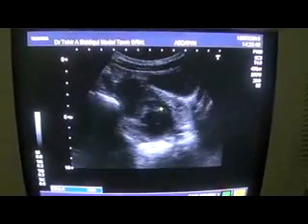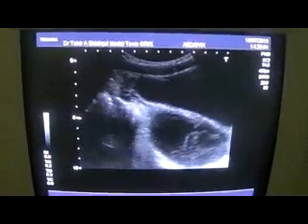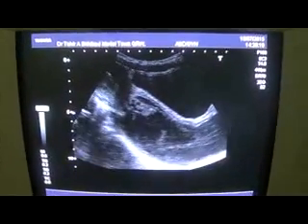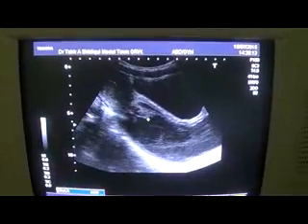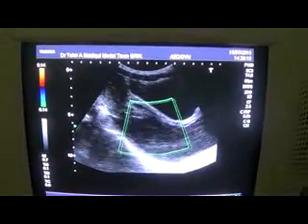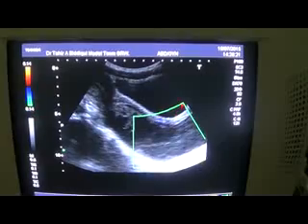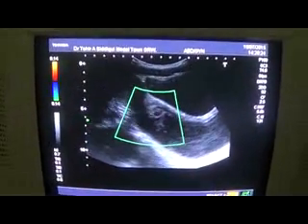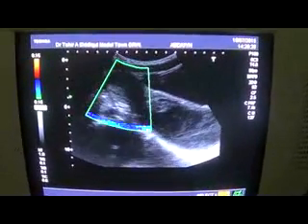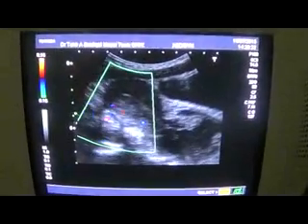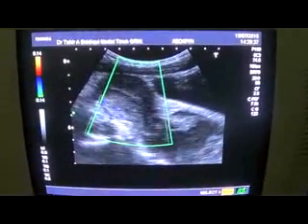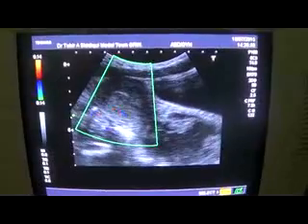This is the urinary bladder, and when I move this globular area longitudinally it becomes tubular. Let's see if there is any blood supply within it. No blood vessels within this dilated vagina full of different-strength echoes. Here we come towards the body of the uterus and fundus of the uterus.